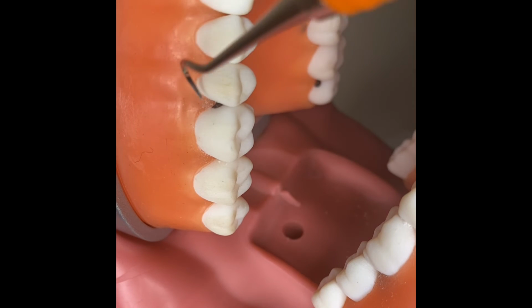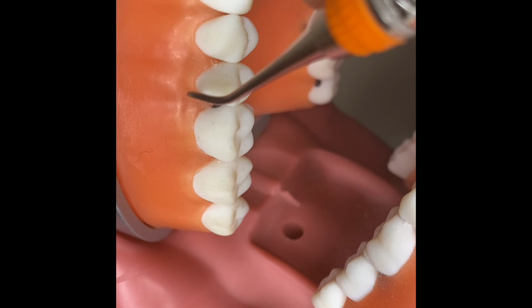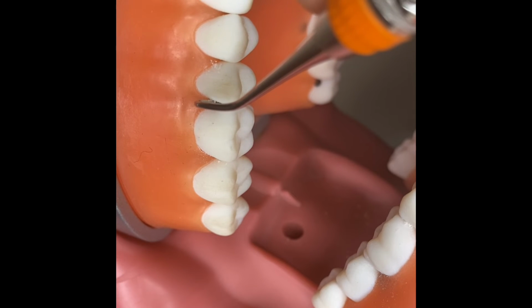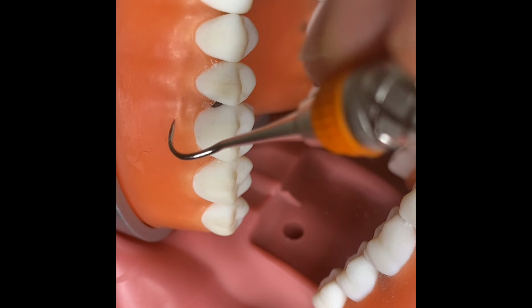And again, number 4, side to side, pivot, roll, up, down, down. I'm going at the mesiobuccal line angle, going towards the mesial.